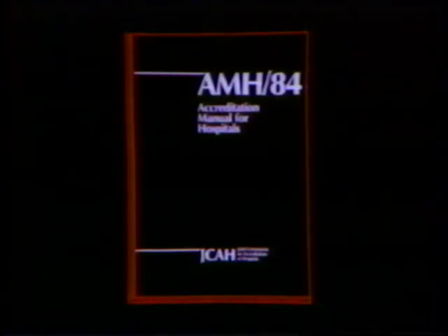Various agencies require that certain quality control tests be performed and recorded regularly for accreditation and licensure of nuclear medicine services. As an example, the Joint Commission on Accreditation of Hospitals has published the following. Standard 3. There shall be quality control procedures governing nuclear medicine services that ensure diagnostic reliability and patient safety.